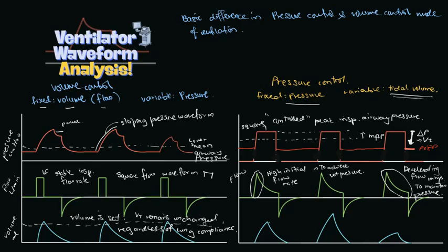And important to remember that in pressure control ventilation, tidal volume is a variable. So tidal volume will vary according to lung compliance and airway resistance. So always monitor the tidal volume when we are administering pressure control ventilation to patient. As you can see, I've amplified the difference of height in the tidal volume to show that the tidal volume can change anytime during the pressure control. So it's important for us to always monitor the tidal volume.